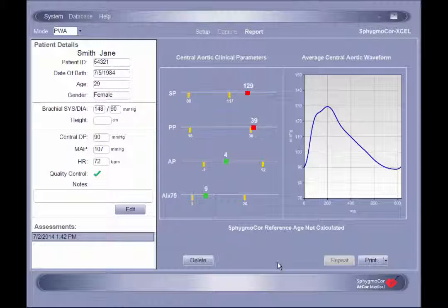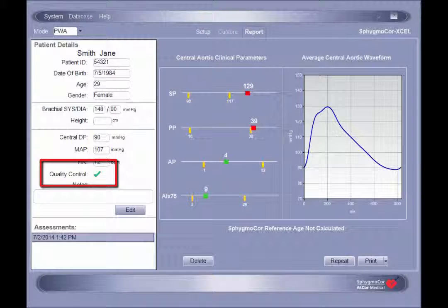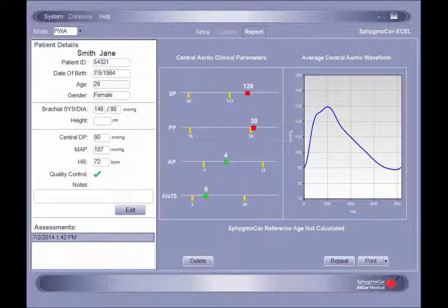At the conclusion of the assessment, the report will be displayed. It is important to always first evaluate the quality control indicator to determine if the report can be considered acceptable. A green check is an indication of an acceptable assessment, while a red cross indicates that the assessment should be repeated. To repeat an assessment, simply click the Repeat button in the lower right-hand corner of the report screen.